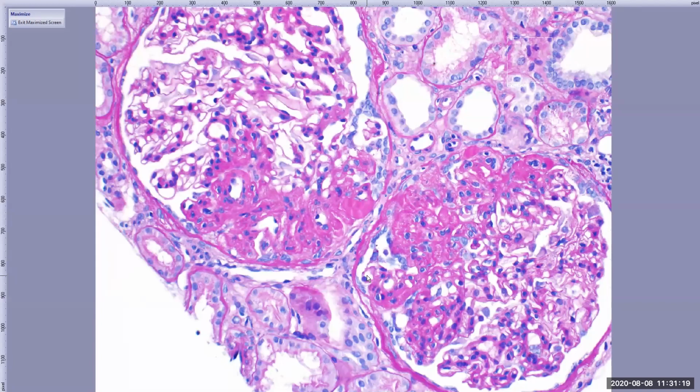And there's a question about these glomeruli, or these two specifically. Are there either hilar or tubular poles here that you can see? Yeah, so I will go over that. Remember the morphology which I showed you last time. That was a nondescript FSGS lesion. So I'm showing you another FSGS because we will follow that same reasoning.